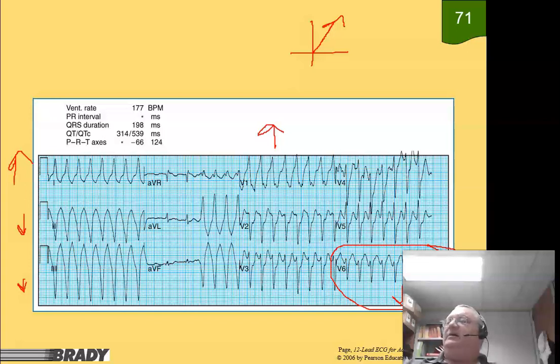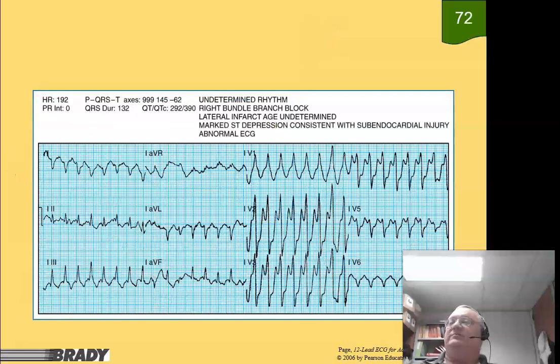Yeah, we got some dissociation here. Matter of fact, it actually tried to break through at this point. If you guys take a look at this right here, it was actually trying to break through, but it went right back into VTAC. So this is a really interesting case, actually. So again, this guy, he's in VTAC. Yeah, he's going to enjoy some high quality Versed, hopefully. Down, up. Interesting. Let's see here.